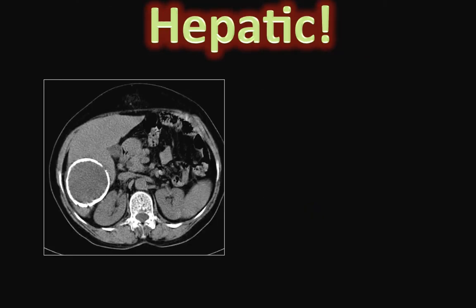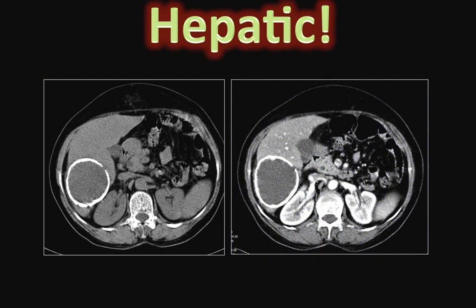Here's the CT on the same patient, showing that the abnormality is hepatic in location. It has a rim of eggshell calcification and an internal low density consistent with fluid, which is confirmed on the post-intravenous contrast acquisition that shows no internal soft tissue components. This basically rules out the possibility of an aneurysm, which is a dangerous diagnosis that we should not miss.